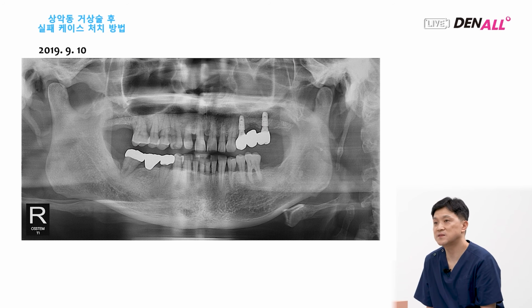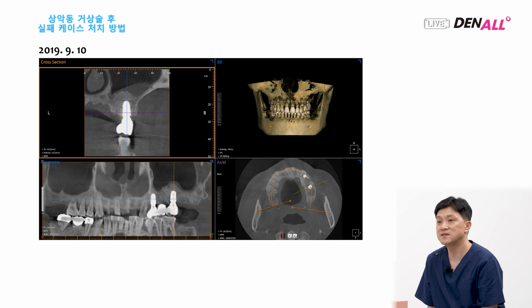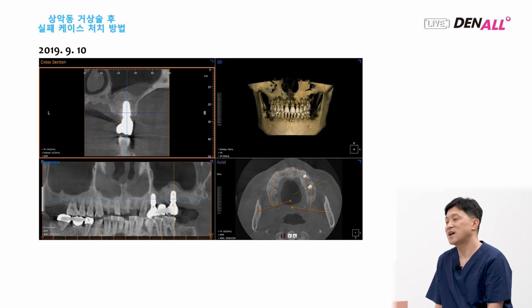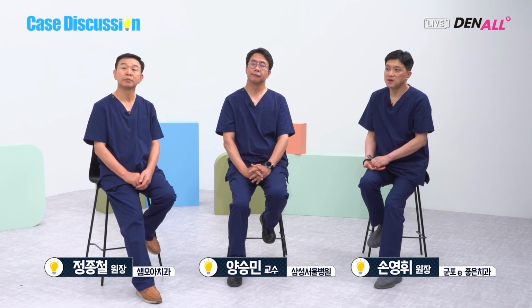So using the protocol, if you look at the CT, the alveolar bone remodeling and bone graft in the sinus are very well maintained. So following the approach, if the patient has experienced a sinus infection, if possible, we need to wait a little bit longer after sinus lift and the bone graft.